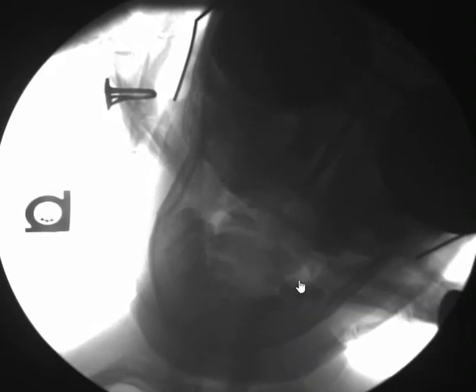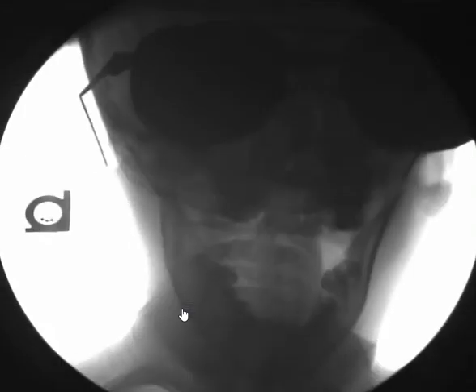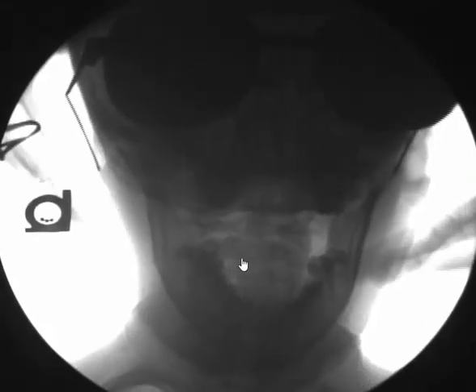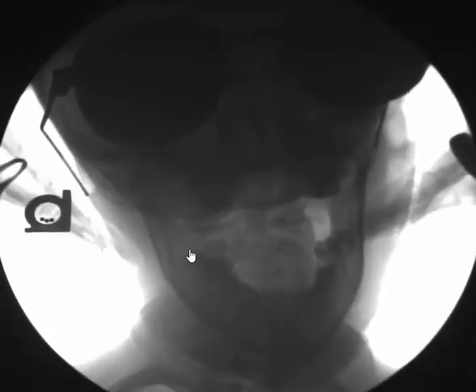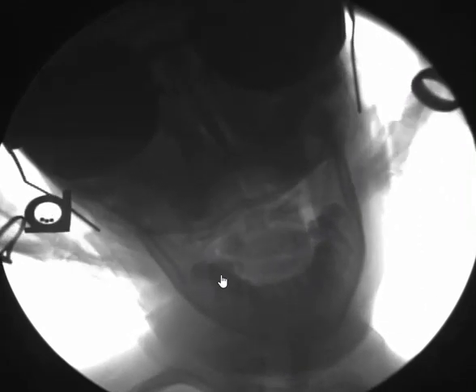So if you have doctors that are doing a static open mouth view, you are really missing a lot and they are not being specific. If you want a specific diagnosis, make sure you get a digital motion x-ray so you can see — look at how hard this view is to really get, keeping her centerline — but you can see the massive amounts of translation.